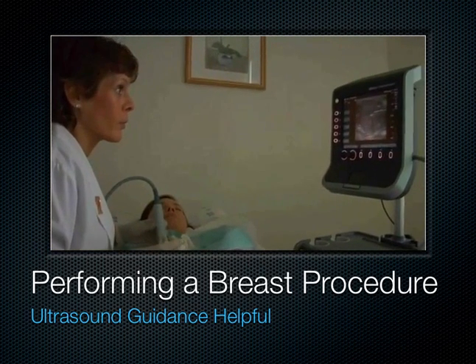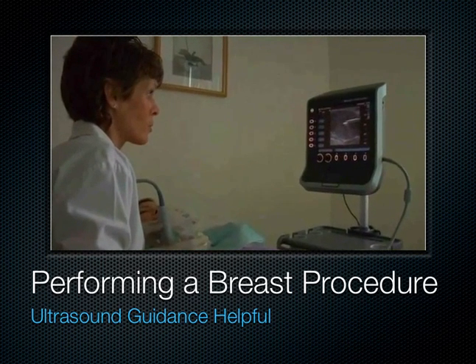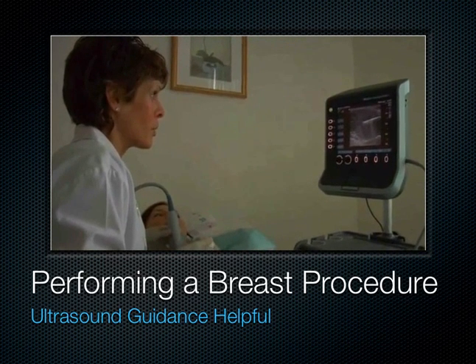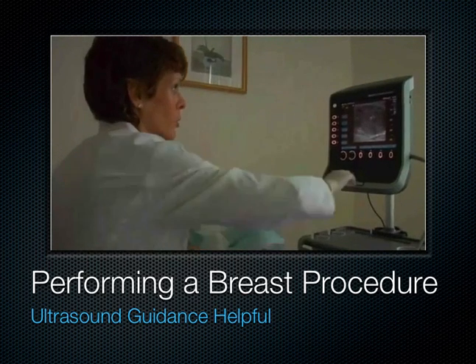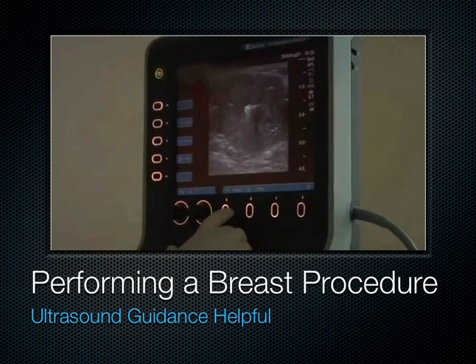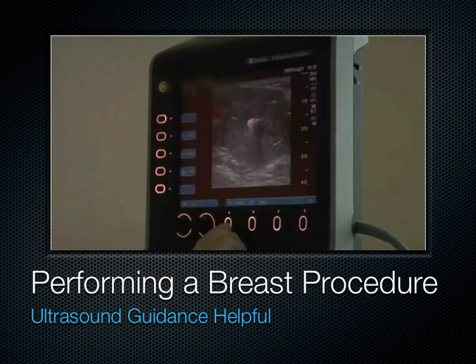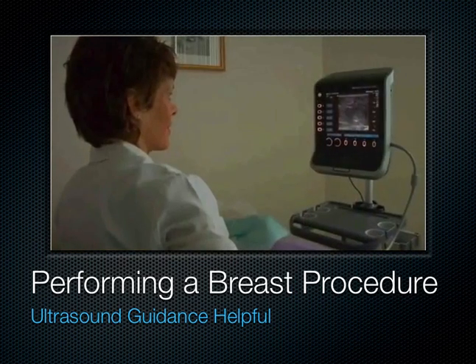This is actually a step we don't always do. In fact, if I've done the core biopsy, this is already done. It's pretty standard when you do biopsies on things to leave a marker in place, and especially with this procedure, because eventually the goal is going to be that the fibroadenoma goes away. We want basically a record on our subsequent mammograms and images where it was.